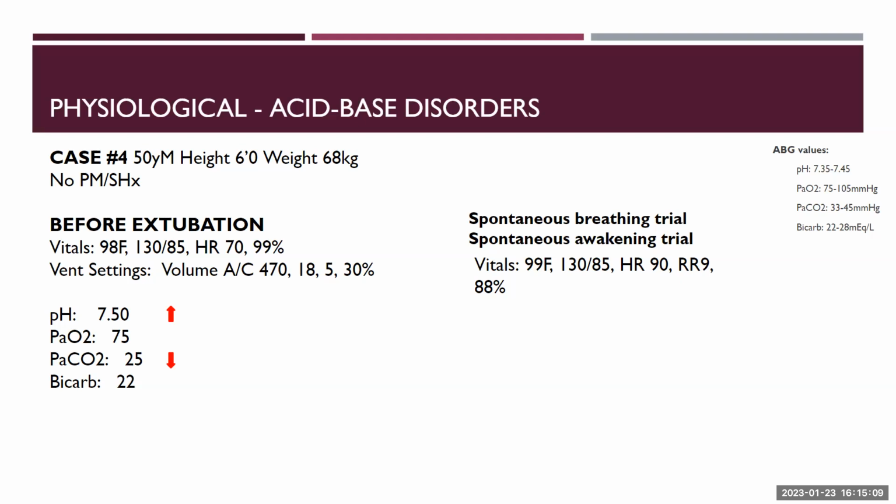Yeah, so the spontaneous breathing trial basically is this: when you're putting patients on mechanical ventilation, and we talked about modes of ventilation in the other module, you're essentially supplanting their entire work of breathing. The ventilator is doing all the work of breathing for them. All they have to do is a little bit of effort, and the patient would start getting the breath from the machine.